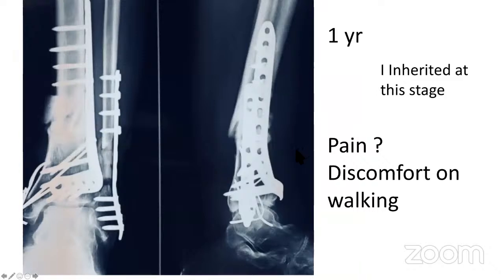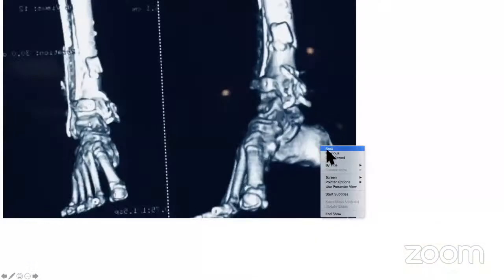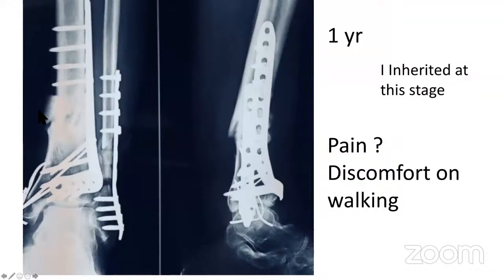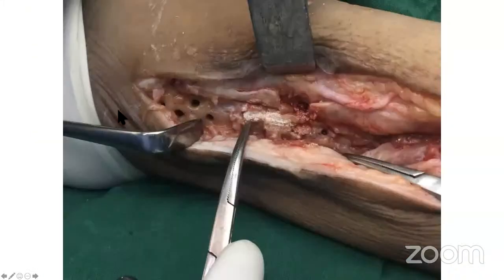You can see, even at 1 year, I inherited the patient with discomfort on walking, and there is still a dense thing seen, exactly as Dr. Chandok mentioned. This was the bone substitute here. Yes, a definite non-union, and see this when I opened up. This is the Indian hydroxyapatite, which cast a shadow. Those shadows were purely because of this hydroxyapatite. The non-union was completely filled with hydroxyapatite. So I removed the whole hydroxyapatite and defined the non-union. Everything had to be emptied out. Removing the hydroxyapatite was a far bigger job than everything else. Having done that, you can see still there is some amount of hydroxyapatite. Here was the medial malleolus which he had treated.